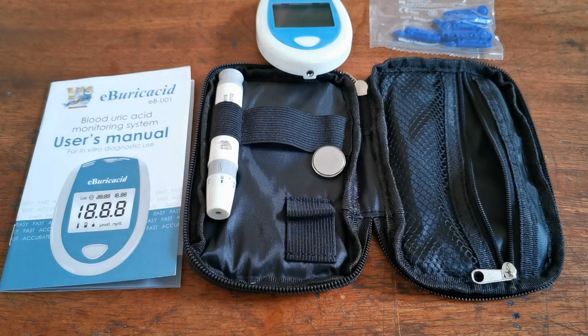Let's show you now how to set the meter up — set the time, date, year, hour, and minute — and then we'll show you how to run your first test.